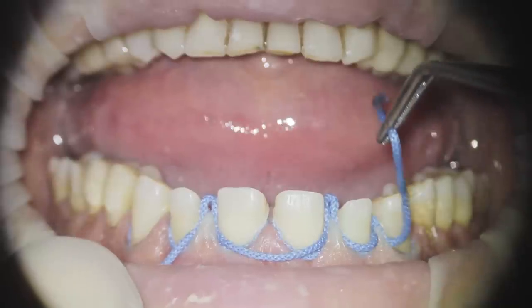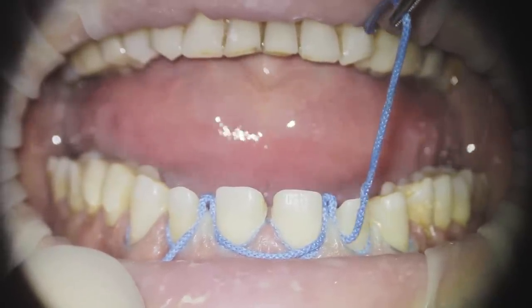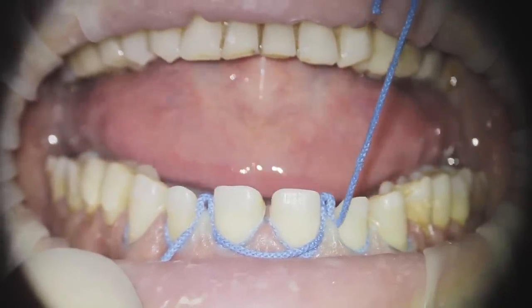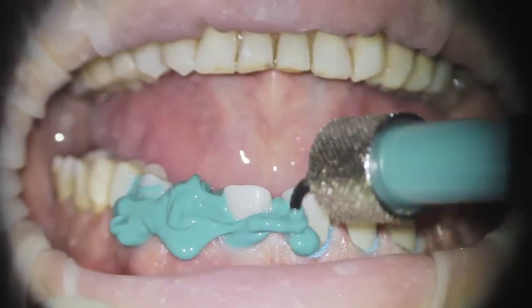You should take the second cord out of the sulcus very, very slowly. The slower you go, the more time the gingiva will stay displaced. I know it's not intuitive — we all try to do it quickly, pull the cord and put the material in — but it's much easier if you do it slowly.